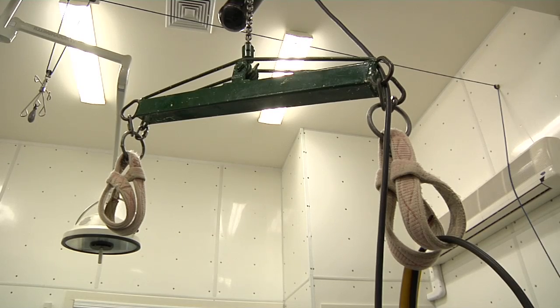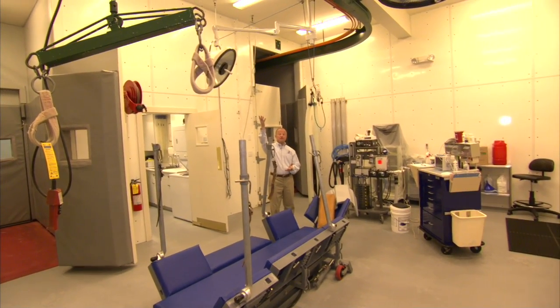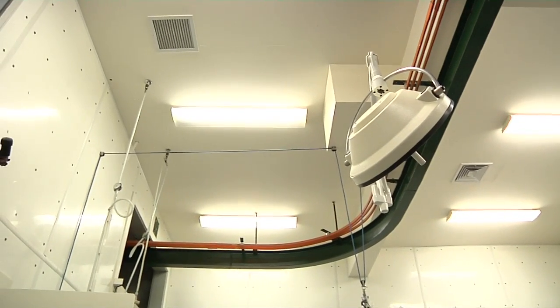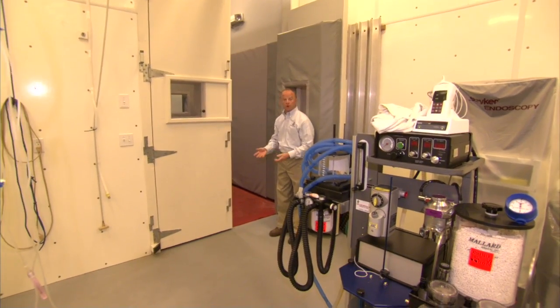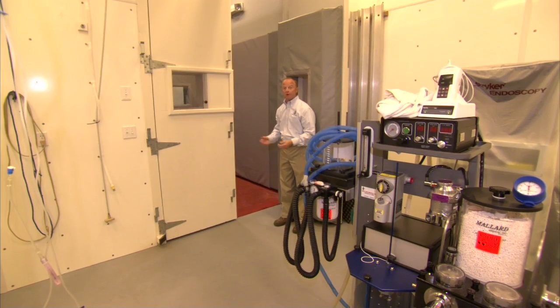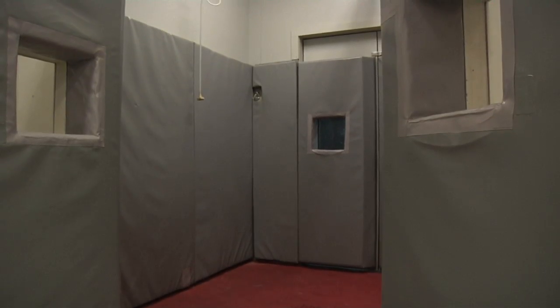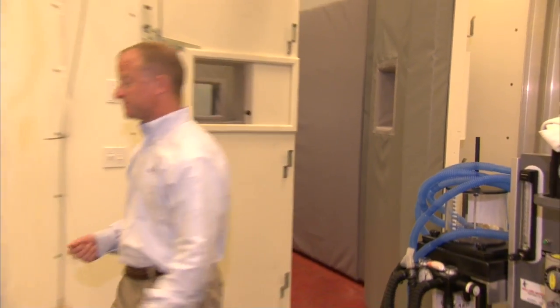Once the surgery is completed, the horse is then attached back to the hoist and lifted off of the table, moved on the monorail system over to the recovery stall. Here they are lowered onto the floor and they are monitored during the recovery period. Now, this can take anywhere from a half an hour up to a couple of hours. The horse is monitored very closely, and as they slowly wake up from anesthesia, they will attempt to get up. Once they've recovered enough and they're stable, we then move them to their stall in the hospital, and that will be our next stop.